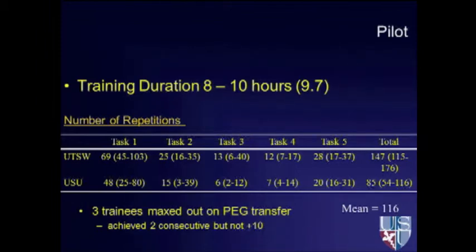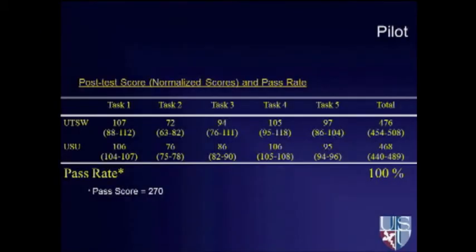But everybody was able to go through the curriculum and at least achieve the proficiency levels on each of the tasks, at least 2 consecutive times. And when they came back for the post-test, you can see basically everyone passed, and everyone passed with a healthy margin. So it was widely applicable and led to good skills retention and good skills improvement.